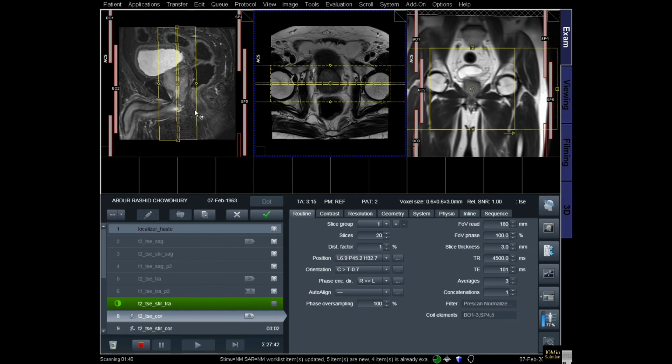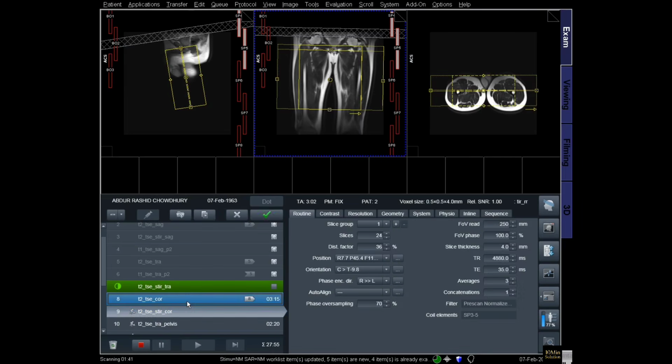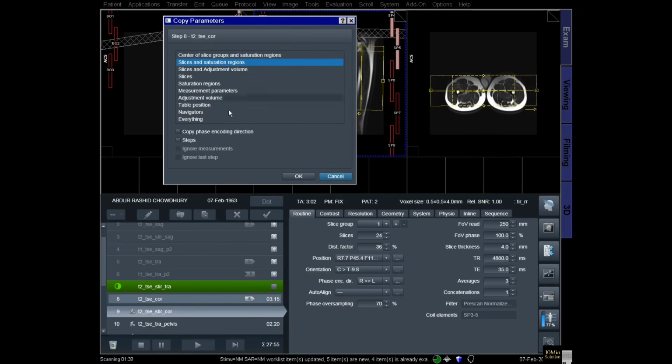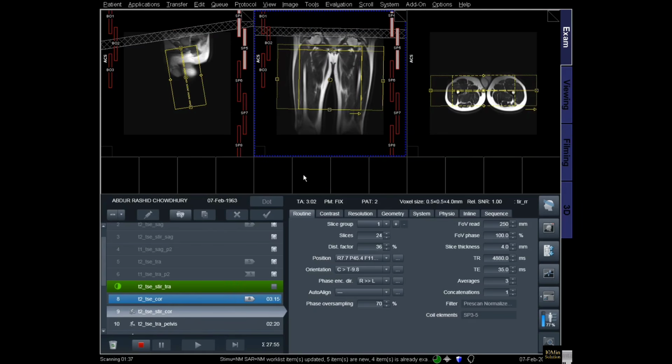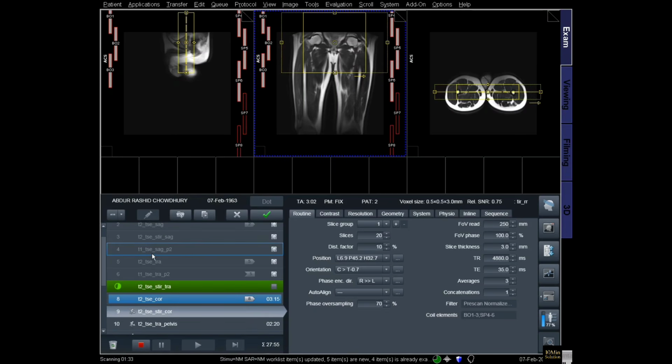Dynamic contrast enhanced imaging, DCE. Dynamic contrast enhanced MRI involves the intravenous injection of gadolinium contrast agent. Rapid sequential imaging is performed to observe contrast uptake and washout patterns within the prostate tissue. Malignant lesions often show early enhancement and rapid washout compared to normal tissue.